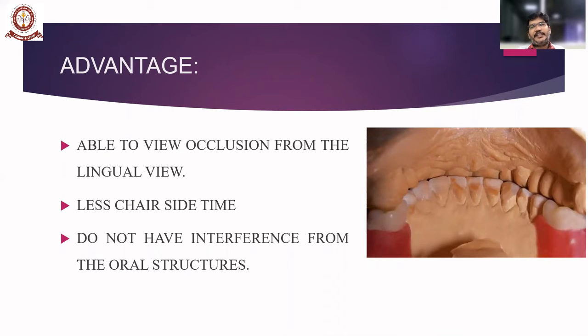The main advantage of an articulator is when you mount the maxillary and mandibular occlusal cast in the articulator, you are able to view the lingual occlusion, which is not possible intraorally with the conventional diagnostic aids. And it also requires less chair time of the patient to establish a proper occlusion or to do a teeth arrangement, and will not have any interferences from the other oral structures, including your cheeks and your tongue.